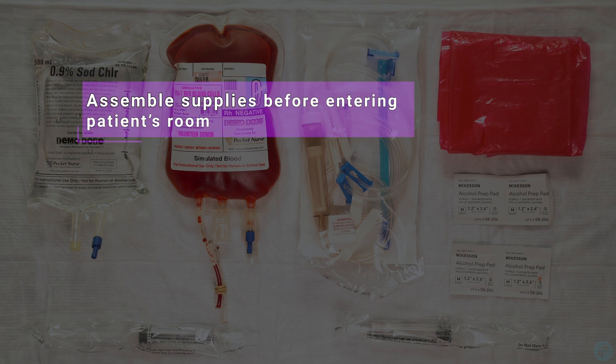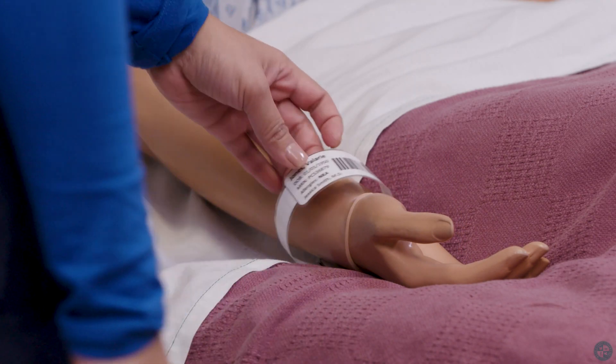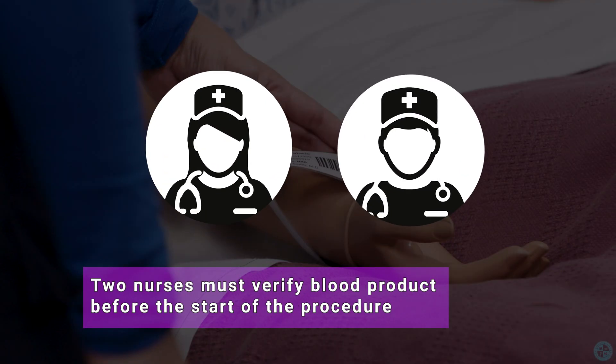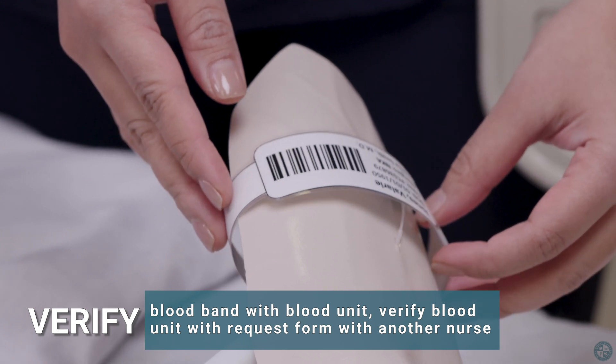Assemble supplies before entering the patient's room. Complete pre-transfusion steps prior to blood transfusion infusion. Two nurses must verify blood before the start of the procedure. Verify blood band with blood unit, and verify blood unit with request form with another nurse.